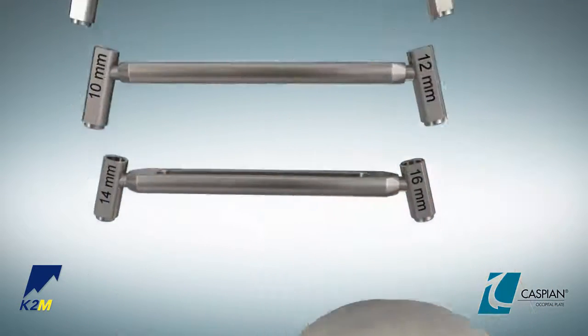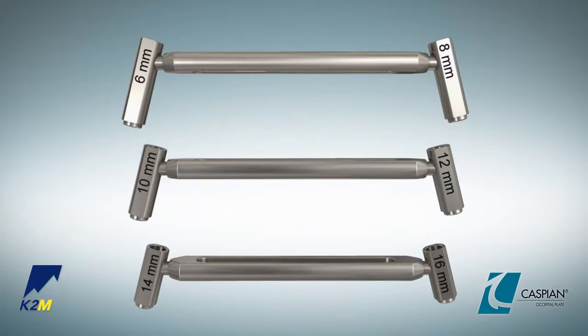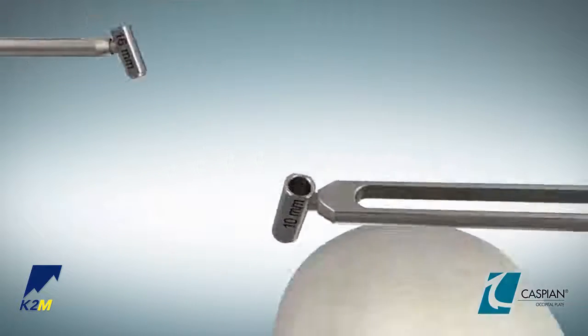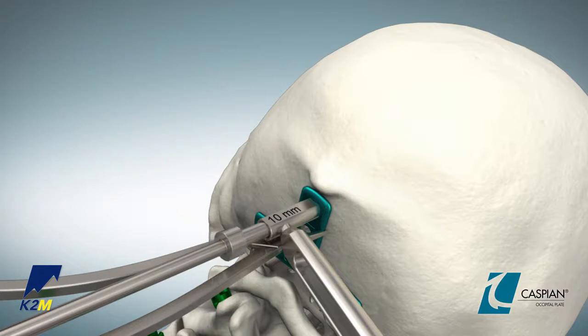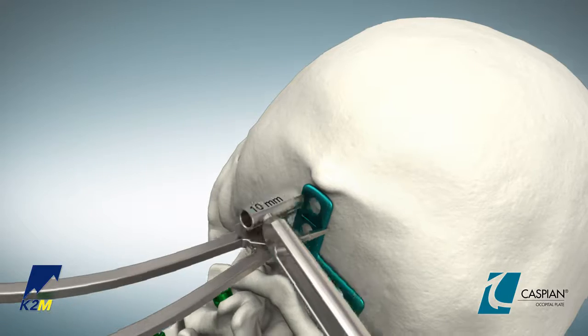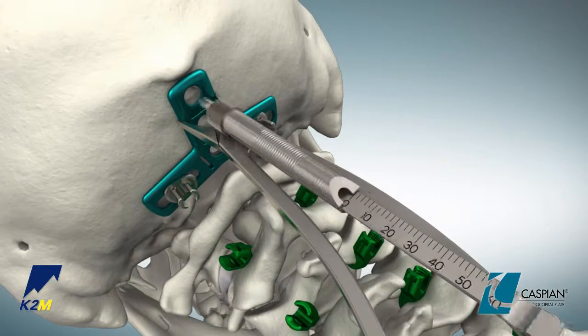Drill guides are offered at fixed lengths of 6 to 16 millimeters in 2 millimeter increments. Select the occipital drill guide that corresponds to the desired drill length. Insert the selected drill guide into the superior screw hole of the plate and drill the pilot hole using the 3.0 millimeter straight drill or 3.0 millimeter universal joint drill. Confirm the depth of the pilot hole with the depth gauge.